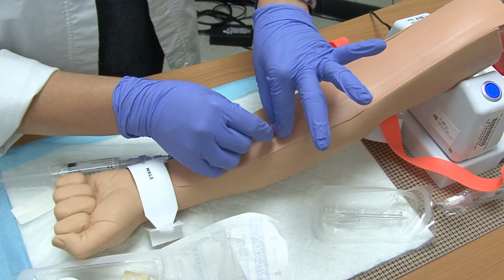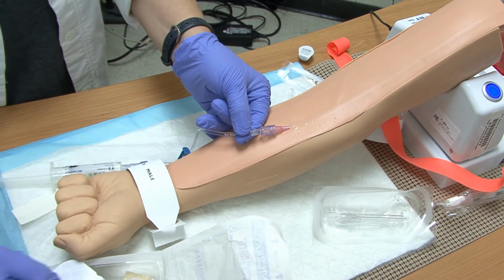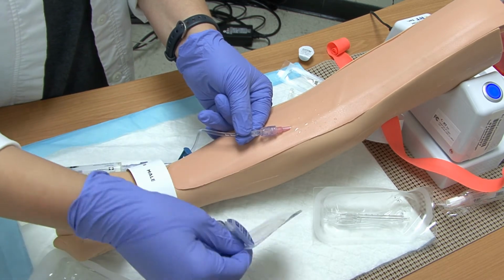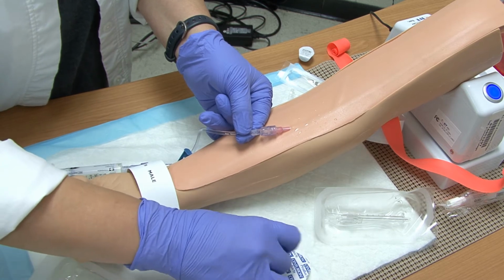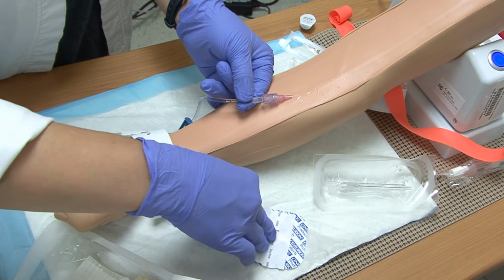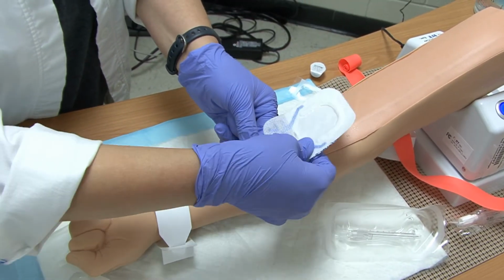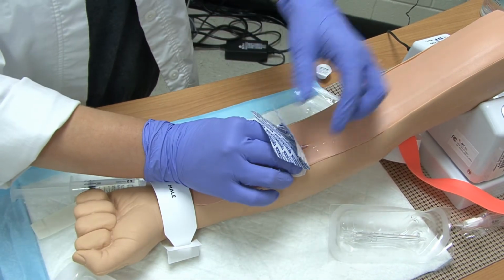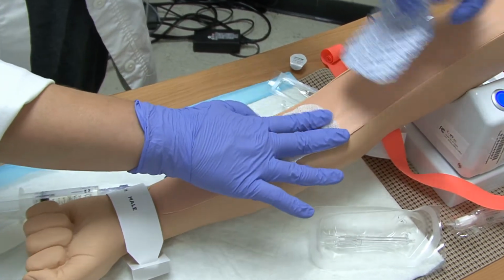Without touching the site, you can again make sure this is attached correctly. Then you're going to come up here and you're going to put your securement device on. And you notice I never let go here of this because it could end up coming dislodged. So as I pull this thing off of here, I usually peel the bottom first. And you want to make sure that you are aware of your agency's policy for how you secure this down, but you do not want to be touching the site up here as you're doing it.